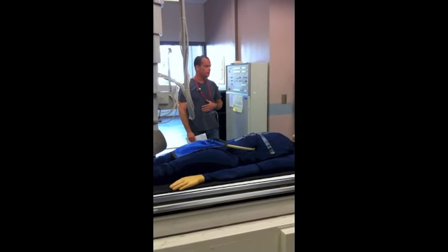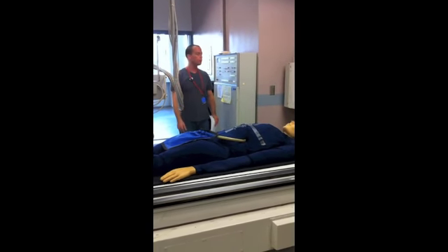When I step back: Sir, will you please take a deep breath in and hold it? Don't move, don't move, don't move. Breathe and relax.